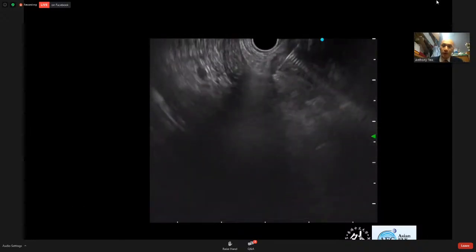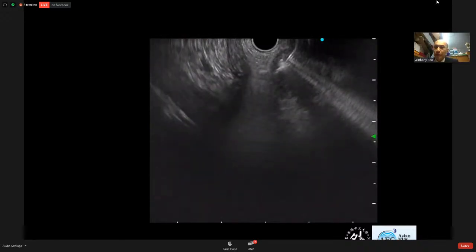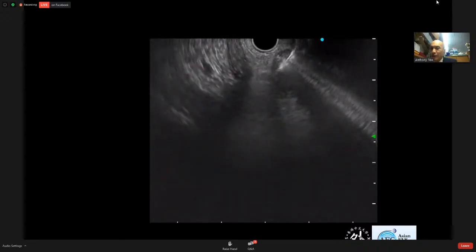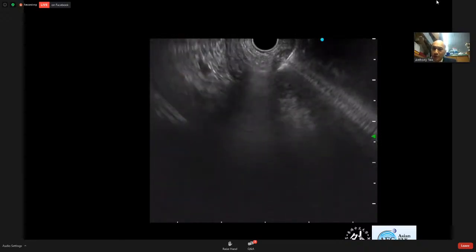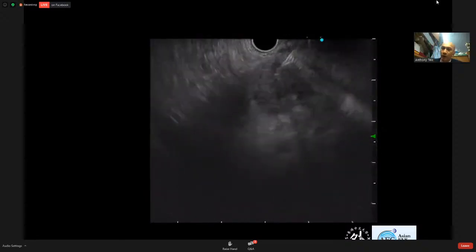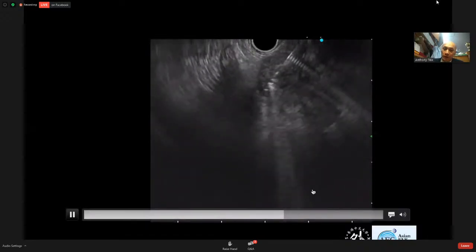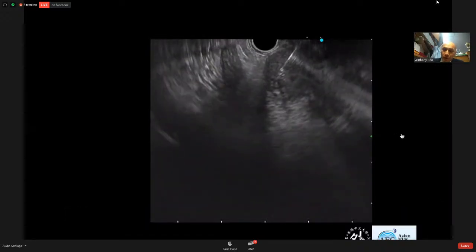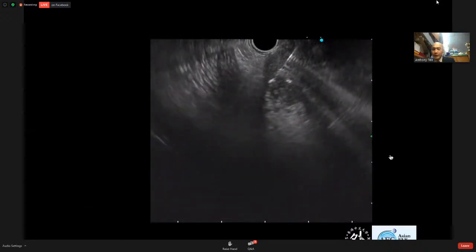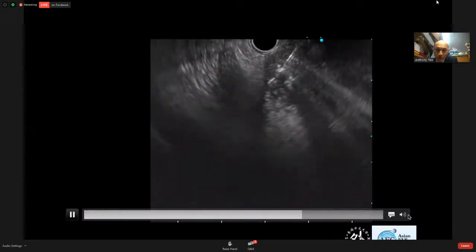Of course, the most worrisome risk of this procedure is pancreatitis. Somehow for pancreatic cancer, I think the risk is lower because these patients already have a tumor right there, and also the PD is obstructed very early on in the disease. So again, studies are ongoing, assessing the efficacy of RFA. So hopefully we will know the results very soon.